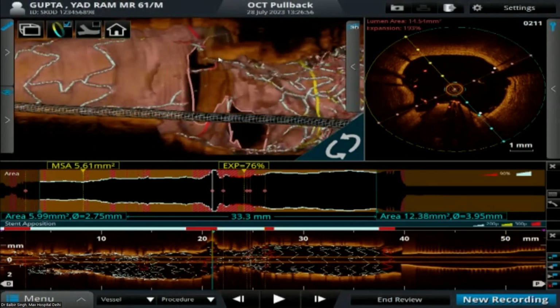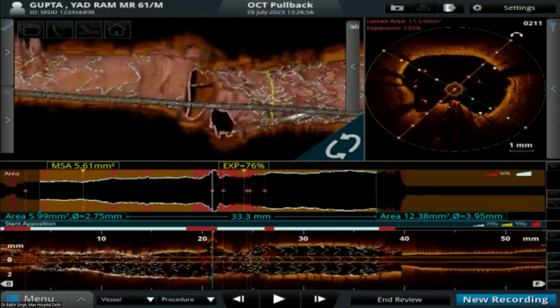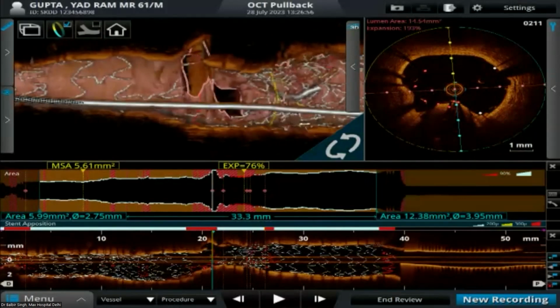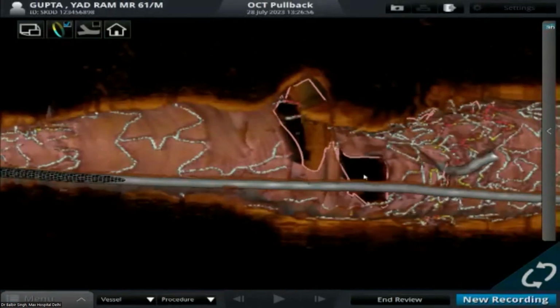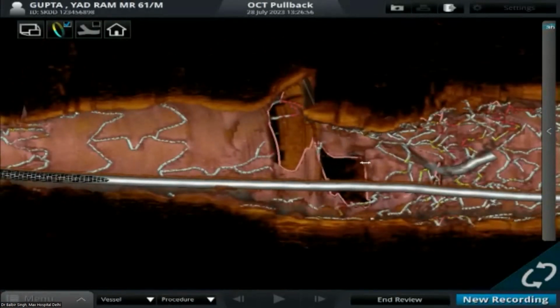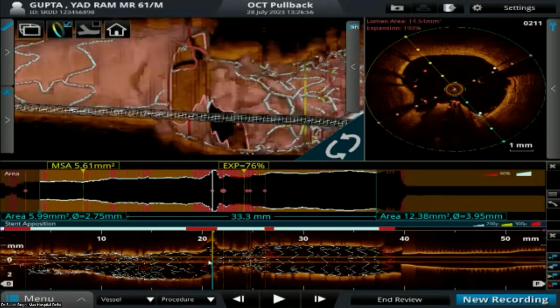You see 2 fenestrations. One is a small branch coming out, and then the circ ostium is clear of any struts, which was the aim of the kissing balloon. Clearly clear of all struts of the left main stent that could possibly be seen. So this is reasonably good. The distal part of the left main with the nodule has an area of about 10 to 11, so we don't bother. Go proximally, we get areas of 14, 15 on the left main, which again is reasonably all right for a good left main result.